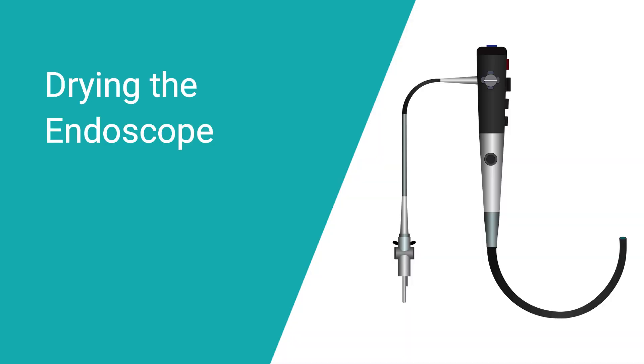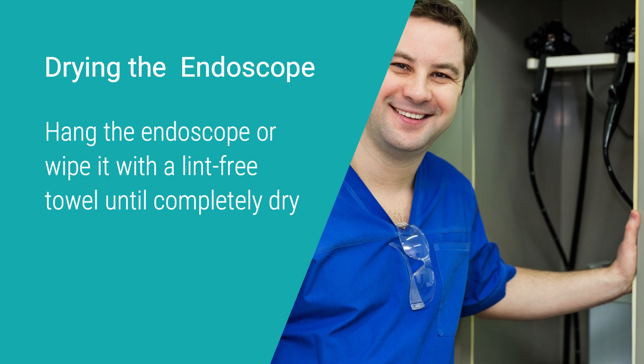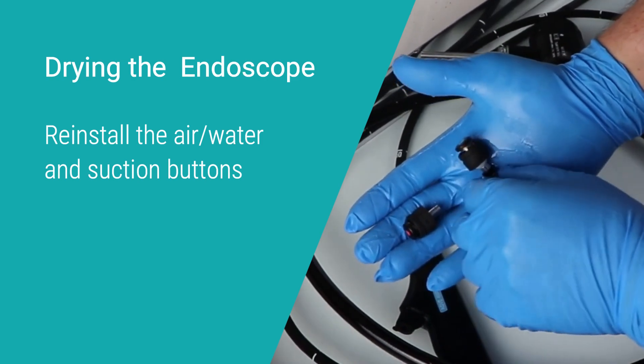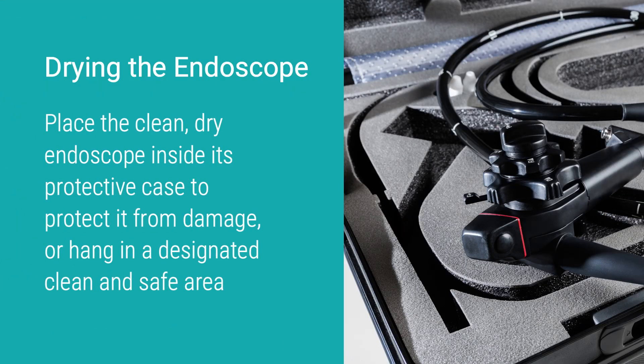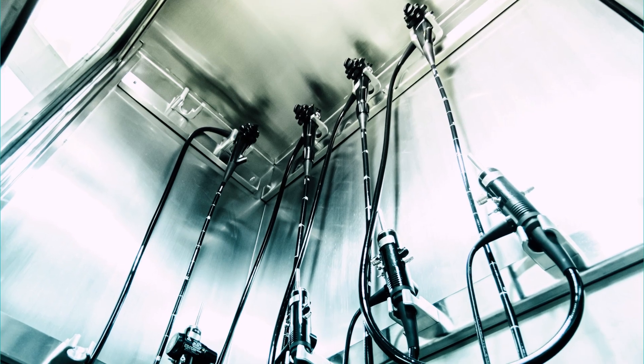Drying the endoscope: using a clean, dry syringe, push air through all the channels to dry them. Hang the endoscope or wipe it with a lint-free towel until completely dry. Reinstall the air-water and suction buttons. Place the clean, dry endoscope inside its protective case to protect it from damage, or hang the clean endoscope in a designated clean and safe area.